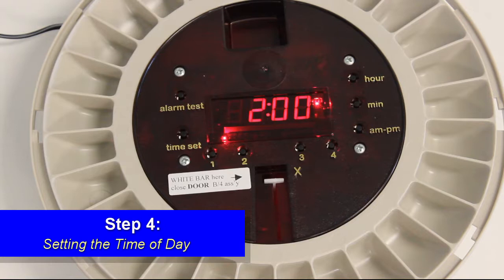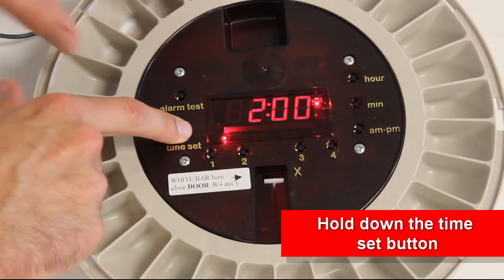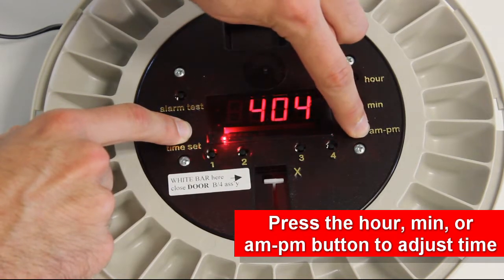Step 4: Setting the time of day. Hold down the time set button and simultaneously press the hour, minute, or the AM/PM button to change the time of day.